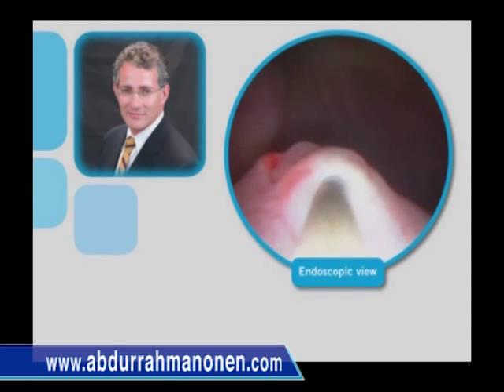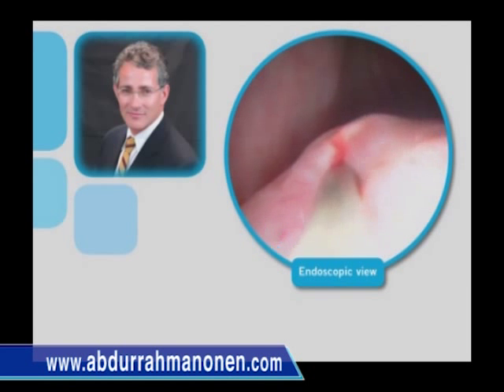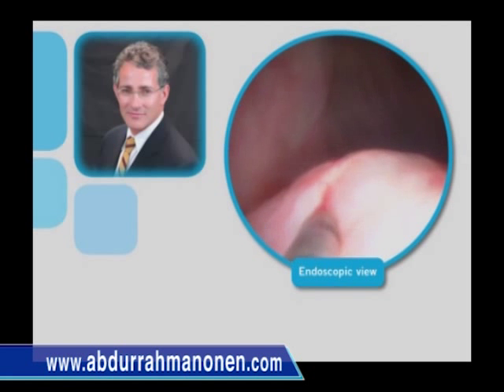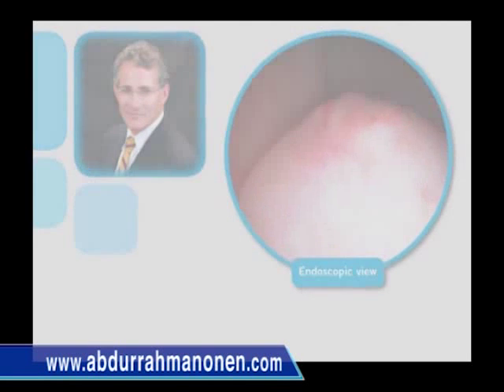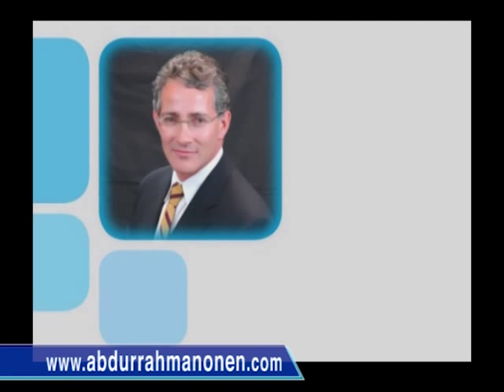Inspection of the final product will show that the ureteral orifice as well as the tunnel is coapted, and hydrodistension will not allow the ureteral orifice to open. Use of the 3 French whistle tip catheter here identifies both orifices, and they are both noted to coapt. Submucosal intraureteral implantation with deflux appears to be a safe and effective treatment for refluxing duplex ureters.